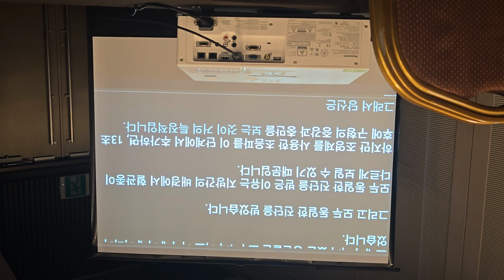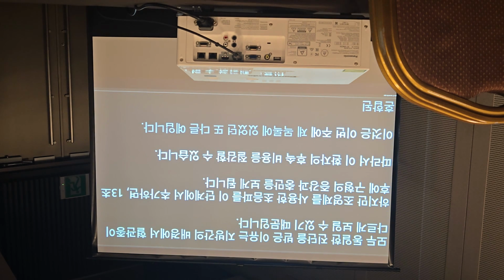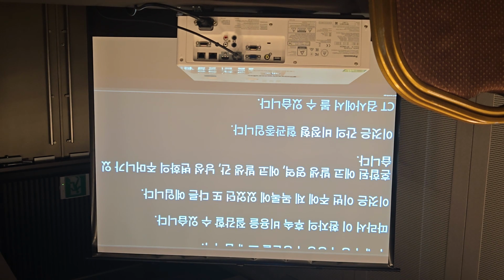And this is just another example that was on my list only this week, where there's a mixed echogenic area, echogenic liver, and pockets of cystic change. And this is an atypical hemangioma in the liver, and you can see on the CT examination there is some enhancement in the arterial phase, and maybe some washout later on, or iso-enhancement with the liver.